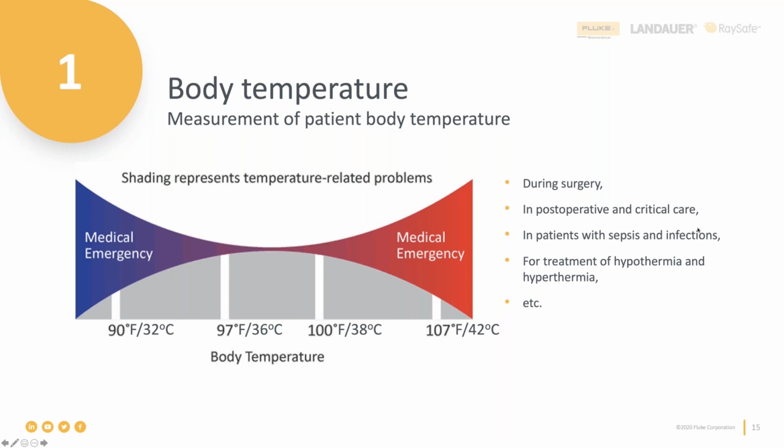Correct. And actually, the next question is really great, which is something that Michael briefly mentioned in the presentation today, but it would be good to elaborate on it a little bit, which is, will there be any variation in SpO2 measurement based on skin color? And which is exactly what we were sharing in chat before. Yeah, and there will be.